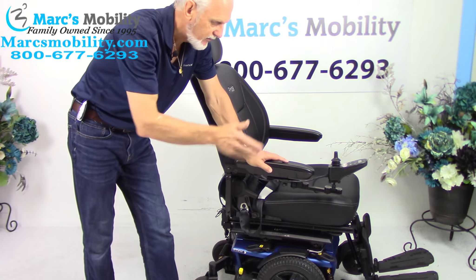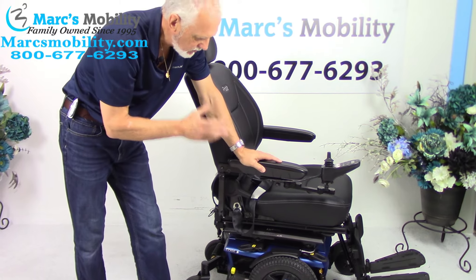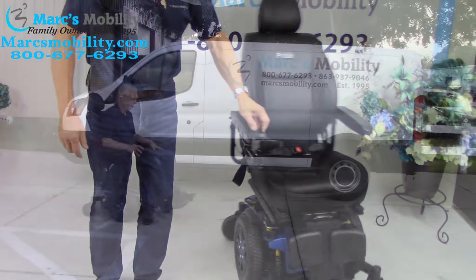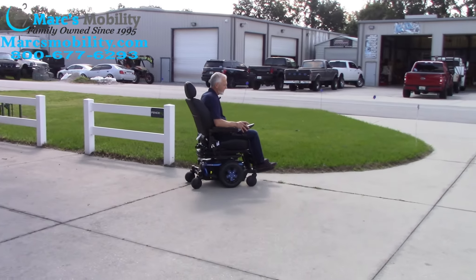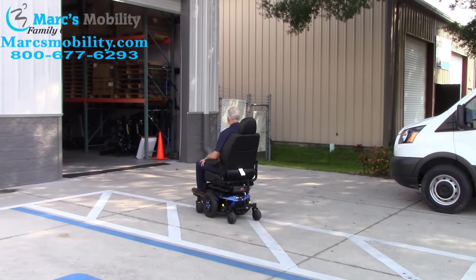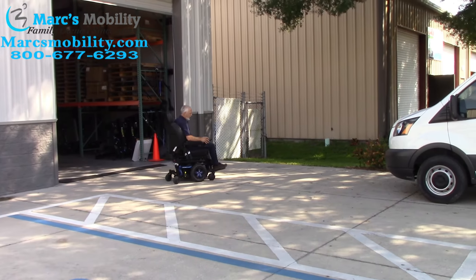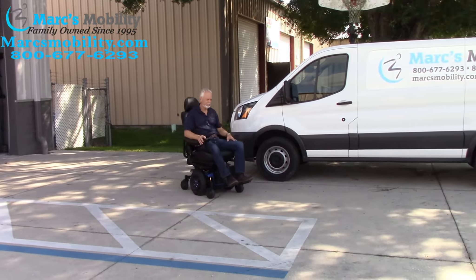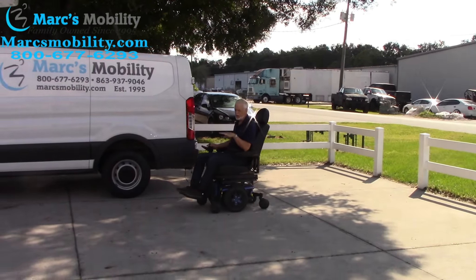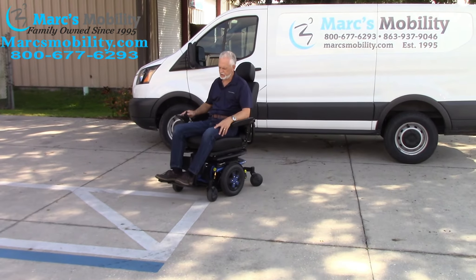Battery range depends on the user's weight, whether you're in grass or going uphill — you won't get as much. On flat surfaces with a light user, you'll get more distance. If you're looking for a really sharp power chair that elevates all the way up to 36 inches, this is the one. The Quantum Edge 3 has great suspension, is very comfortable and very easy to drive, with a top speed of six miles an hour — you can actually feel the suspension as you drive.